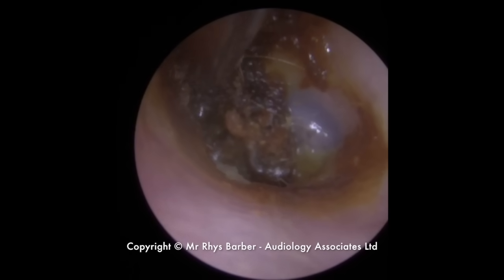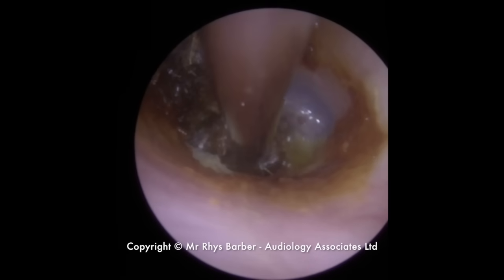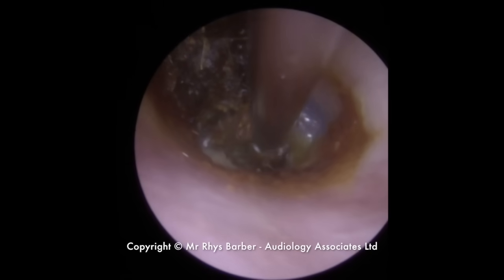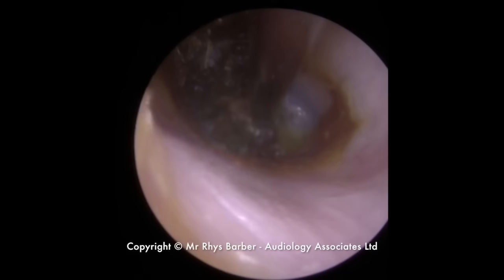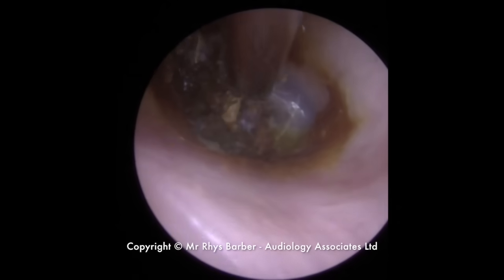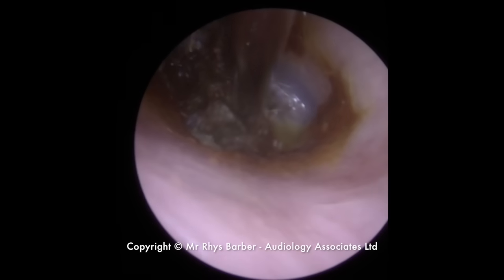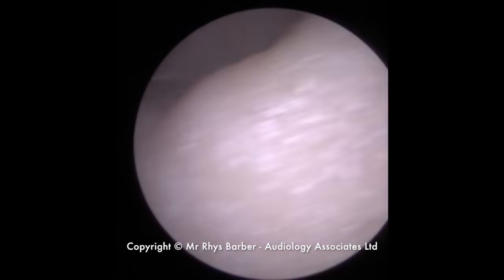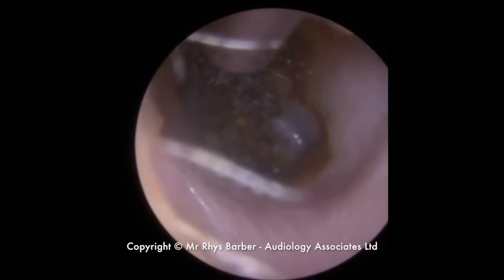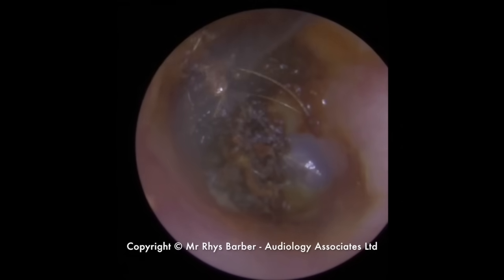You can see that there's one solid plate there at the top. I find it difficult to try and find any way that we can get a good grip on this wax. This is why it was such a difficult extraction — because you're working in a really confined space, very limited movements in here. And you're working with the fine end, which makes it a lot harder because it blocks up so easily. And because it's such a hard piece of wax, it's not getting sucked into the machine at all. It's just blocking the suction end constantly. So quite a laborious task getting this one out.